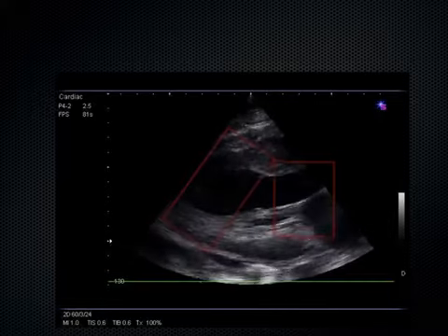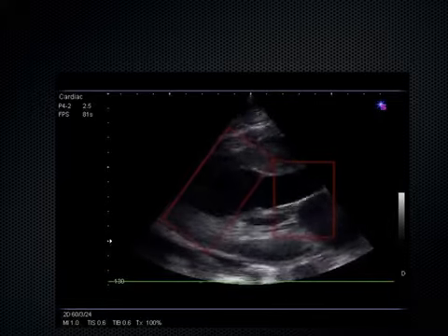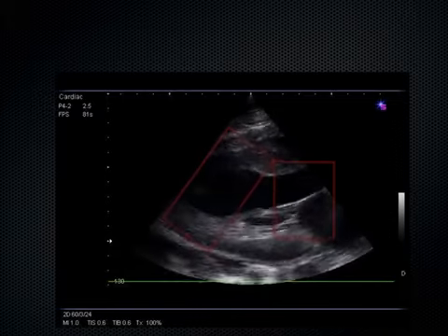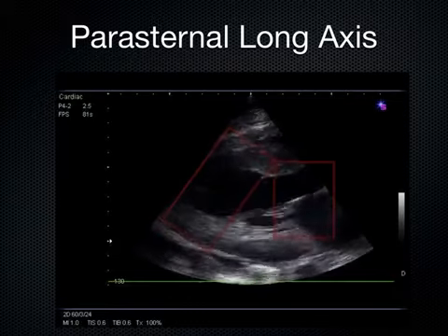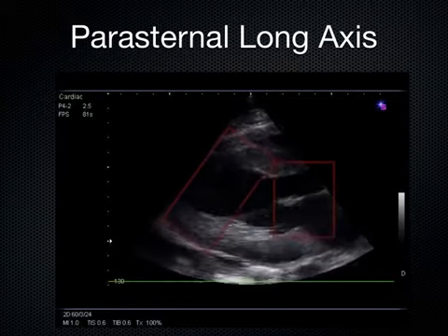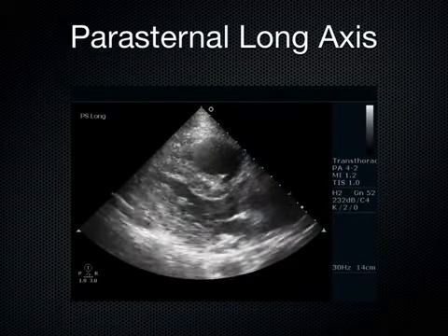Because when the nurse comes to you and says, hey, this patient's hypotensive, we've got to resuscitate this guy, how much fluid should I give him? That's their first question to you. So you just have to be very careful that you don't just start dumping fluids into a heart that looks like this. That's why with anybody who's hypotensive, I immediately go to the bedside and take a look at their heart, and then I make a decision about whether or not to give fluids at that point.